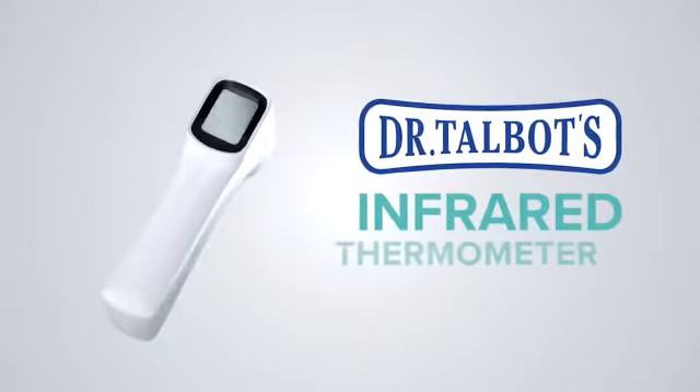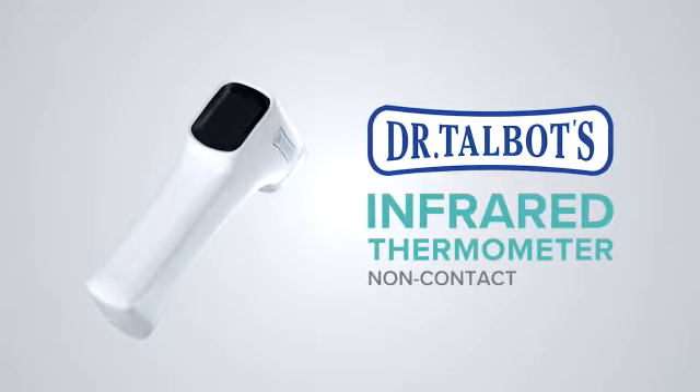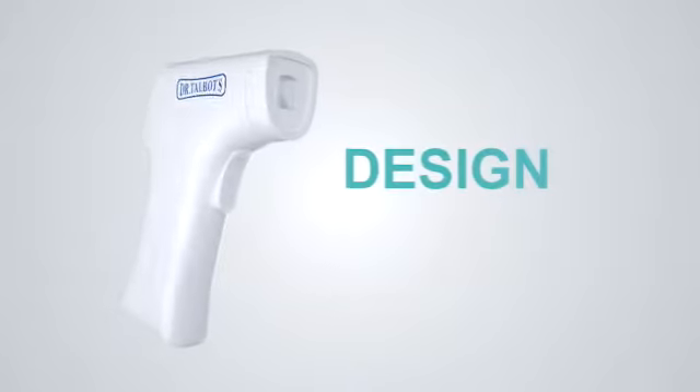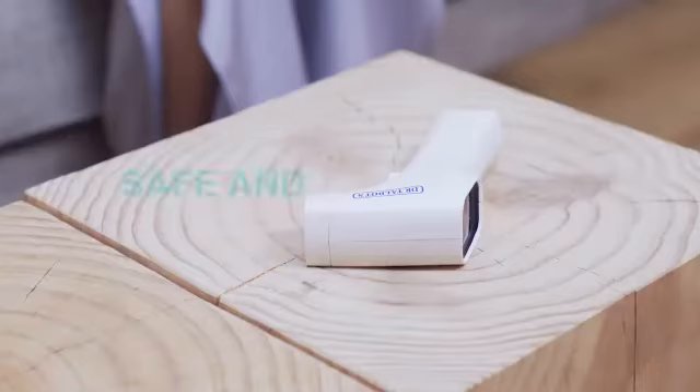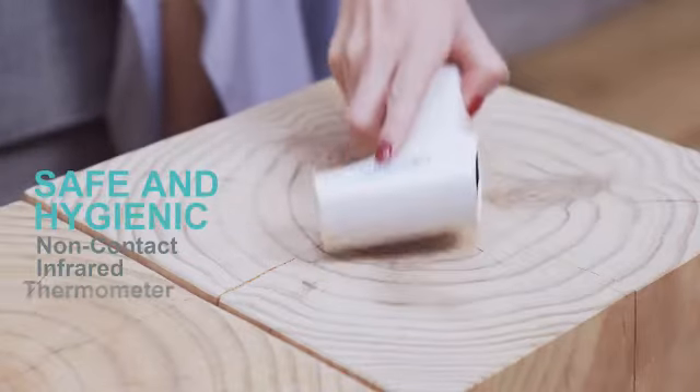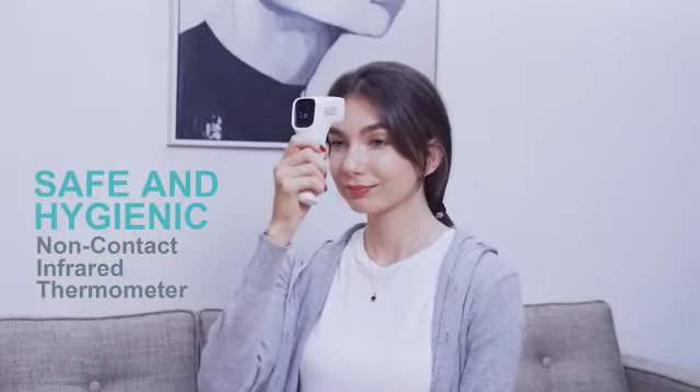Introducing Dr. Talbott's non-contact infrared thermometer. With ergonomic design, easy and comfortable to grip. Safely measure temperature without touching skin — you no longer have to worry about cross-contamination.